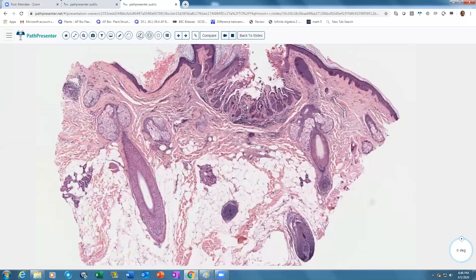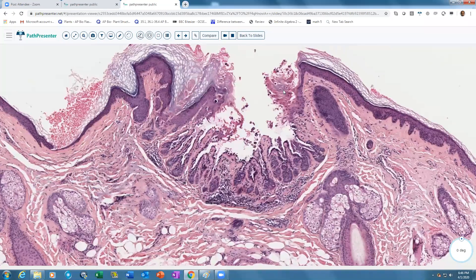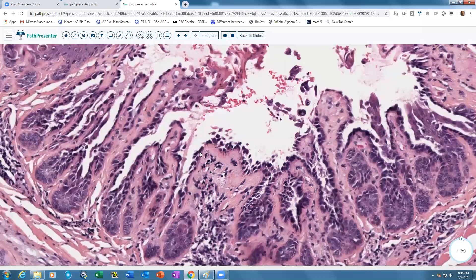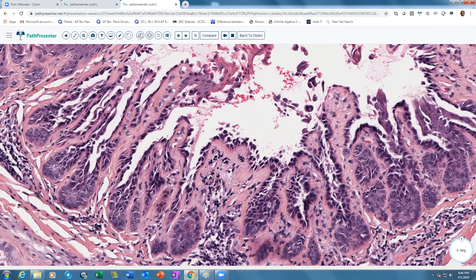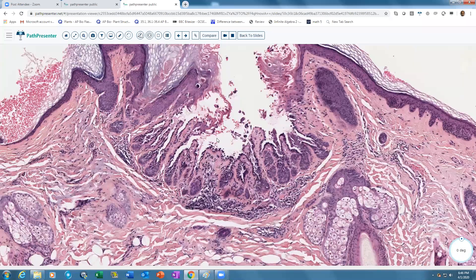On biopsy, warty dyskeratoma shows a cup-shaped invagination within the epidermis, usually with a keratotic plug on top, and a suprabasilar or spinous-layer split with villi-like structures — dermal papillae with attached basal layer protruding as villi into lacunae — and single acantholytic keratinocytes floating in those lacunae. This is usually associated with the hair follicle. The clinical presentation of a single lesion in the head and neck area is also very important.